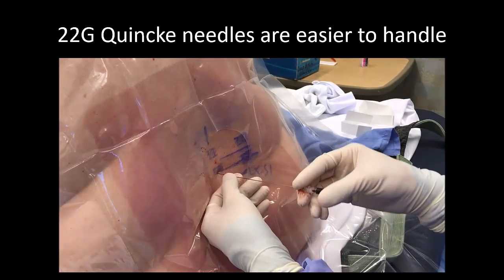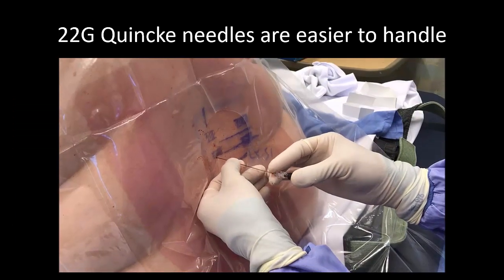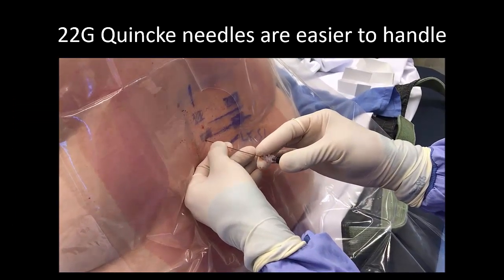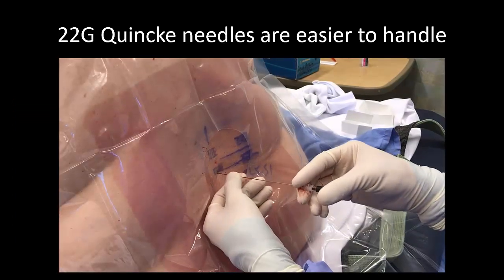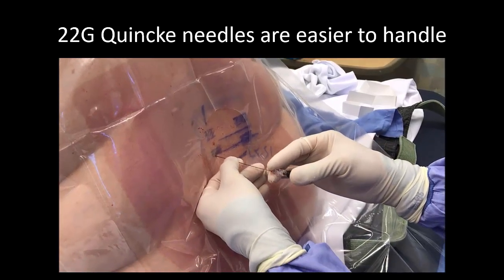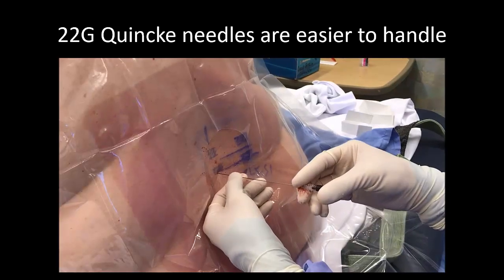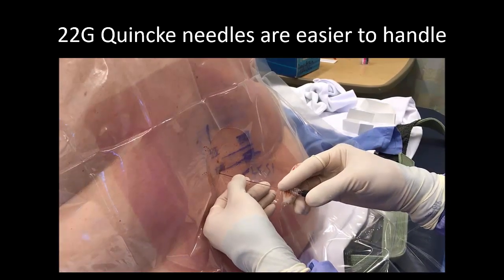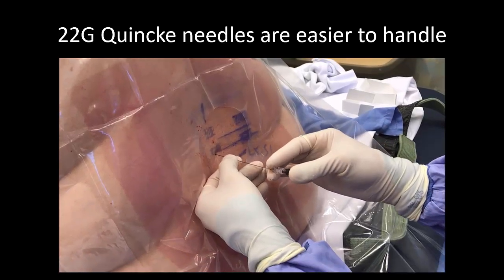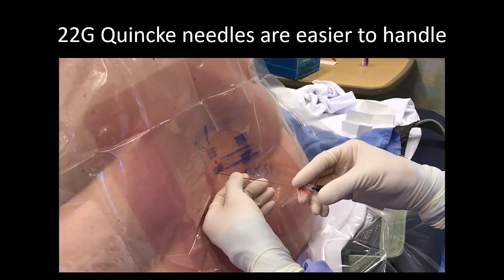Rather, I ensure that the marks have been made with the skin in the neutral position and am then meticulous about inserting it without distorting or stretching the skin out of this position. Note too that I use the incremental feeding motion to advance the needle with my left hand, while my right hand supports the hub and keeps the needle in a straight line. This technique also gives me tactile feedback from the needle tip.